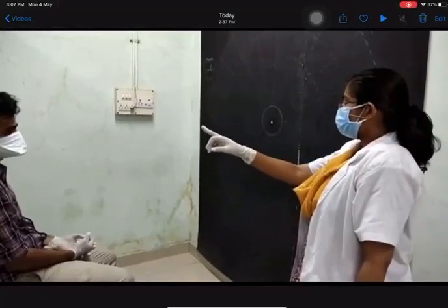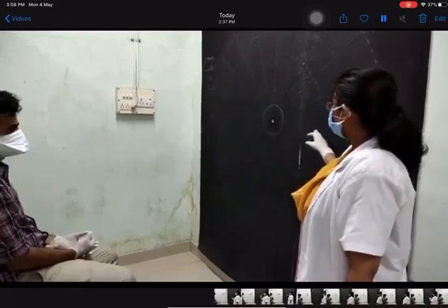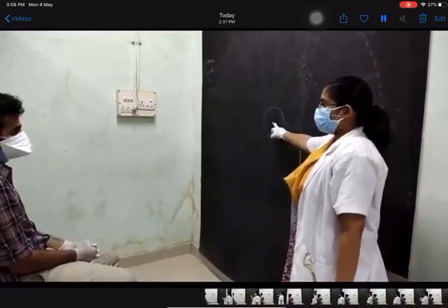So we have shot a video on how to do a Bjerrum's tangent screen test. Before doing the procedure, explain to the patient in the patient's language how to do the procedure, and make sure that the patient is seated at the correct distance. For a 1 meter tangent screen, the patient has to be seated at 1 meter. For a 2 meter Bjerrum's tangent screen, the patient has to be seated at 2 meters. Always make sure that the patient's eye is at the same level as the white dot or the central dot of fixation. So here I am going to test the patient's right field of vision.